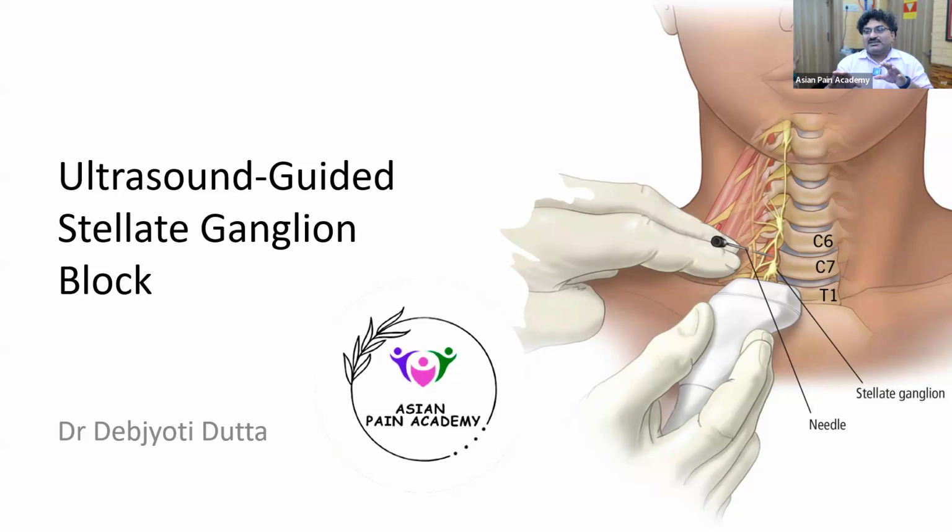So here comes the big difference. Under ultrasound guidance, if you are getting a good path at the level of the C7, you can go at the level of the C7 and your drug volume drastically reduces. Whereas at the level of the C6, we usually give around 10 ml of local anesthetic and steroid mixture. Whereas when it comes to the C7, you can just give 5 ml. And that amount of the drug is usually good enough to produce the action.